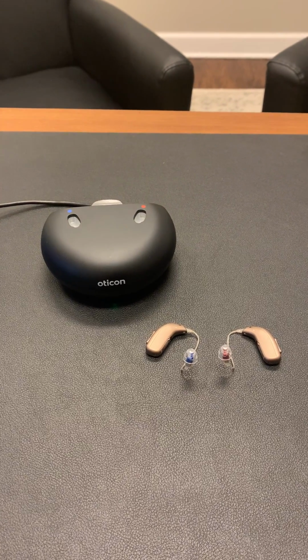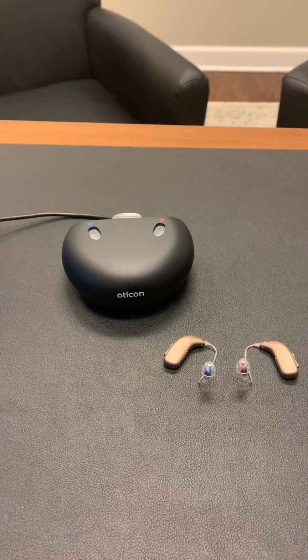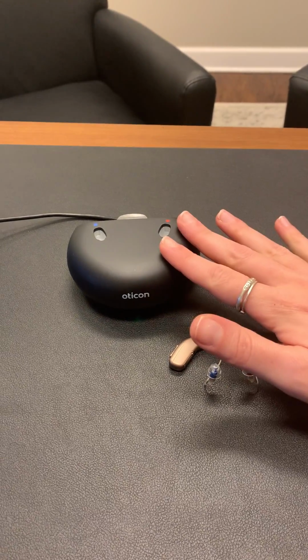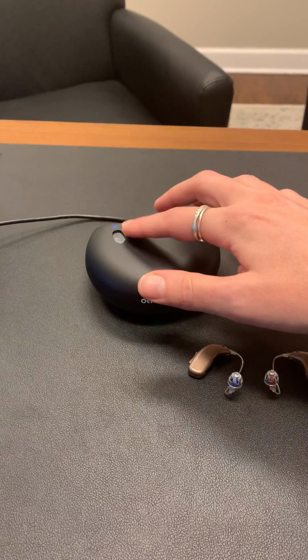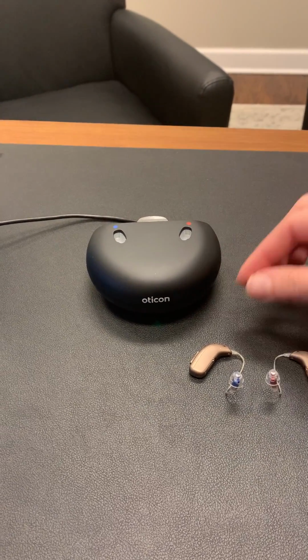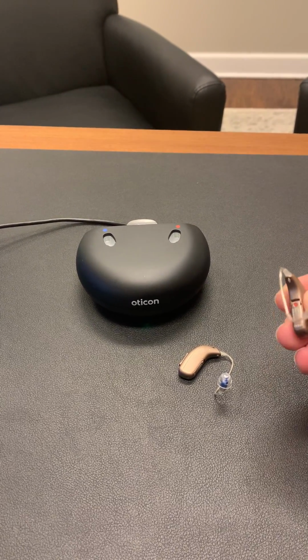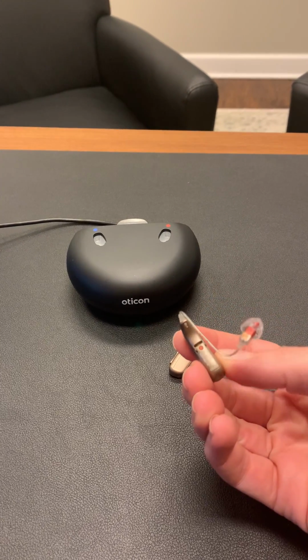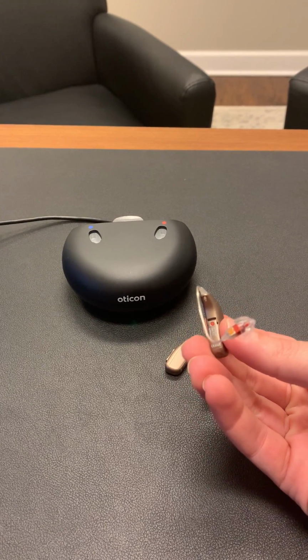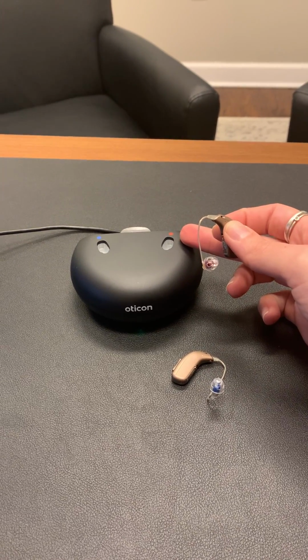Today I'm going to go over how to charge your Oticon open devices. As you can see in front of me, we have the charger as well as your hearing aids themselves. You have a blue and a red dot that coincide with the blue and the red of the hearing aid. If you take the right device, you will see red on the base of the hearing aid itself as well as on the receiver. That will then match up with the red on the charger itself.